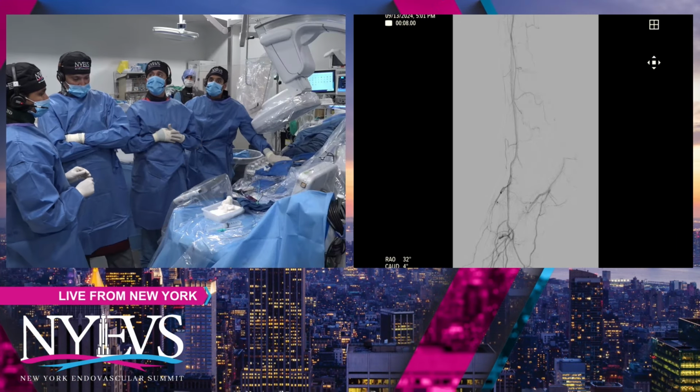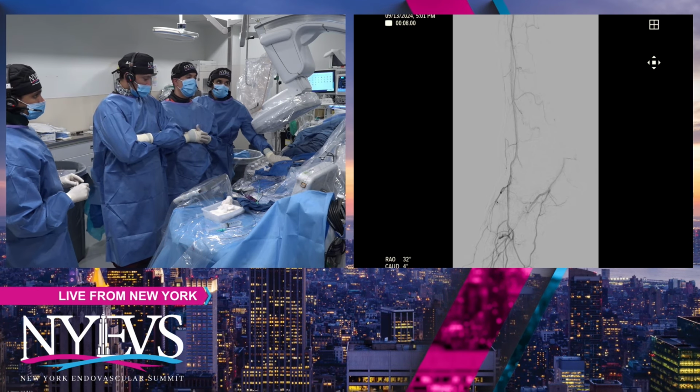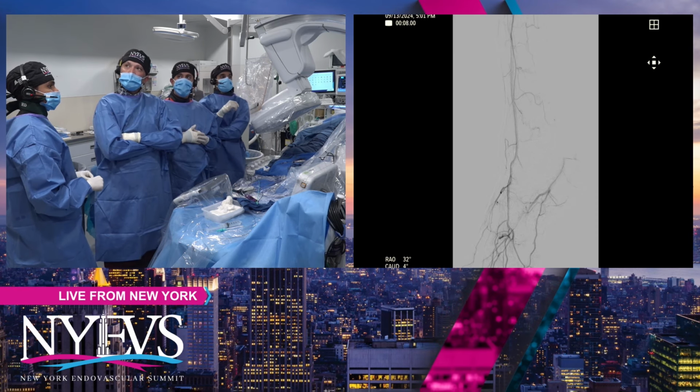Yeah, I'll just say something first. I'm glad to see that you did a completion angiography, especially into the foot, to really define things, because it's a little ill-defined because of all the disease at first.